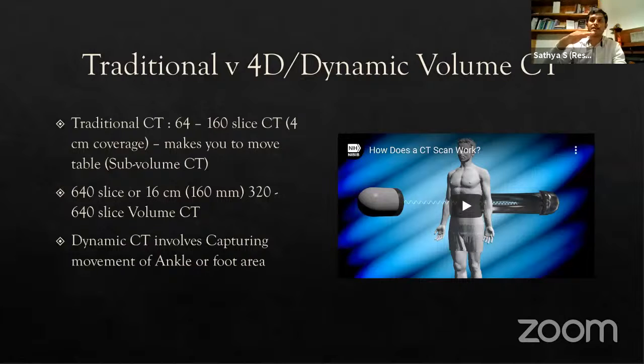So it means a person's foot and ankle can be completely covered, or for a person of my stature, the whole body scan can be done easily without moving much on the table. Rather, the machine will automatically take the whole image of the area that is involved.